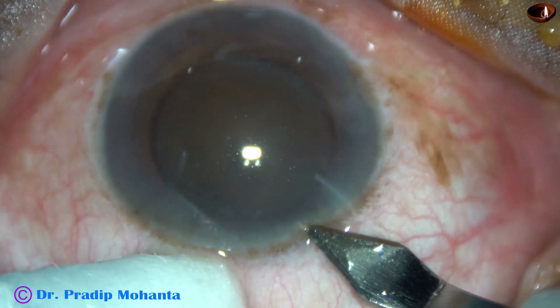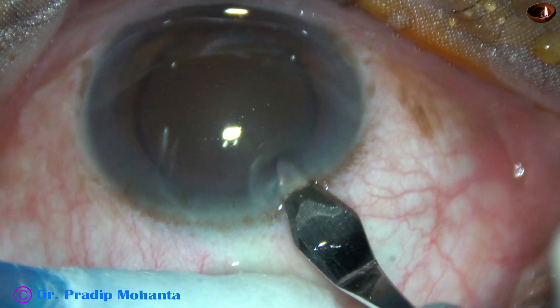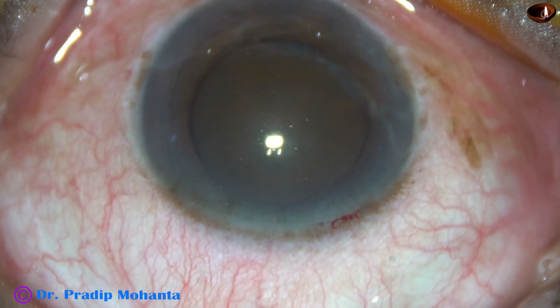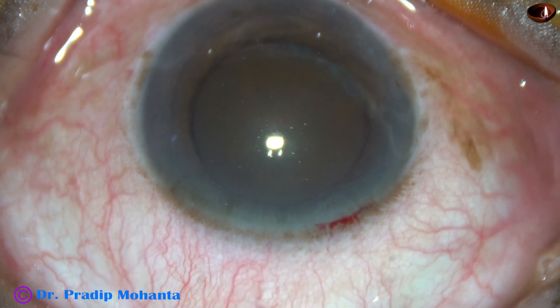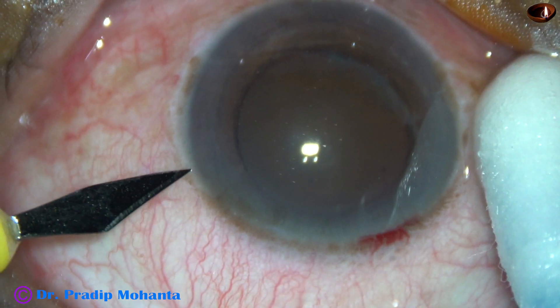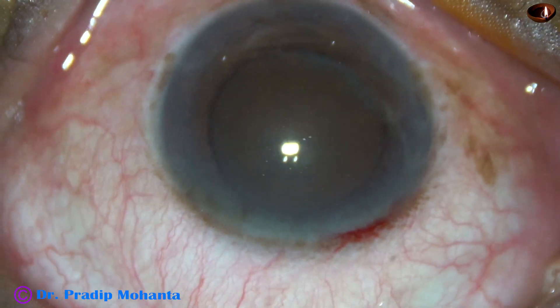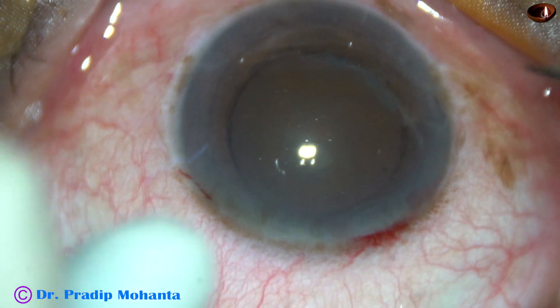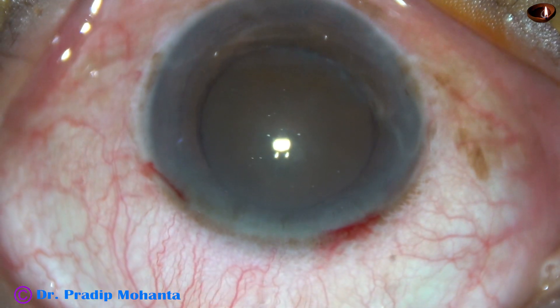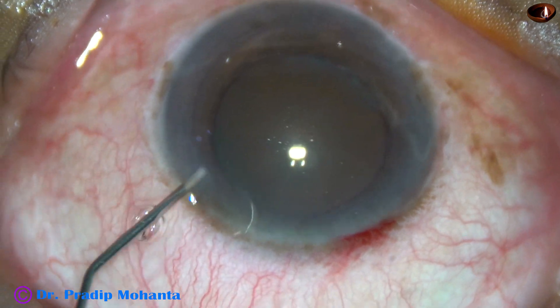This is the main incision with a 2.8 mm steel keratome at mid-limbus. And now, only one side port has been made in this case. This is the side port, about 3 o'clock hours away from the main incision. I thought of doing another side port, but it was not done.